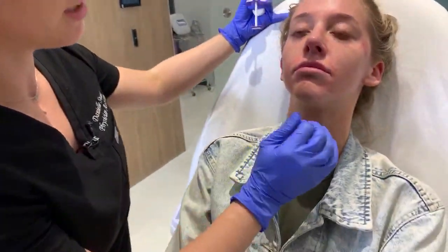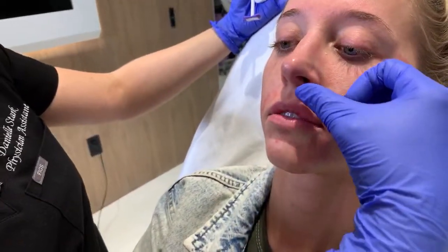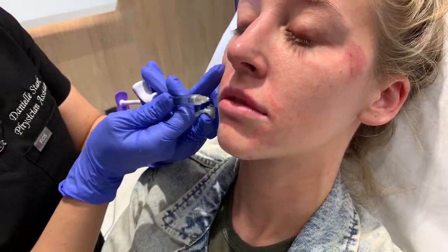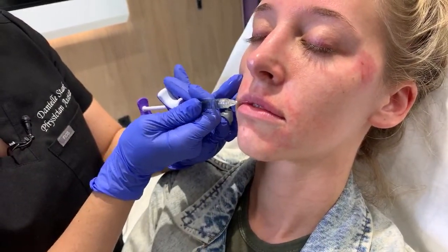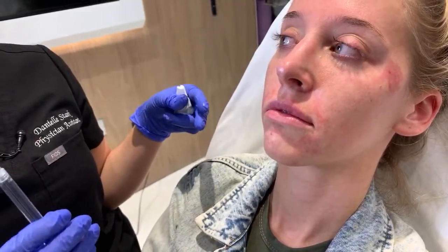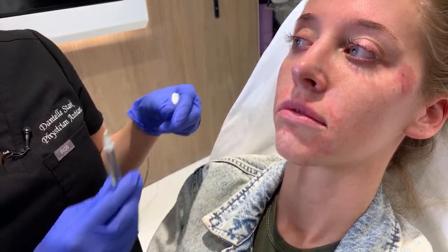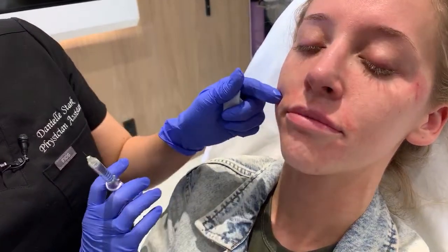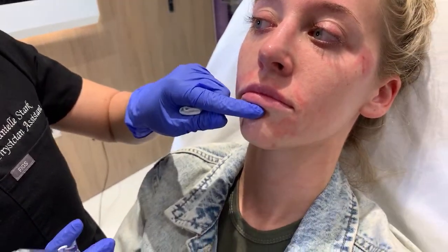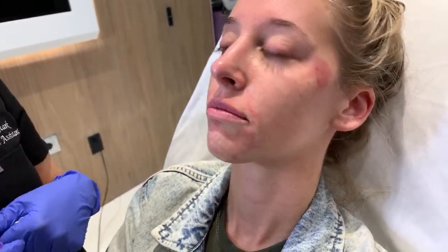Put your head back for me. So far I've injected just a touch up here. I'm going to point with my needle so don't move around, but she's got these little gaps kind of right in the middle and off to the sides of her upper lip. I just want to soften those so there's not much deviation through her shape, and then a little bit of enlargement. Not a ton of size on top, and then we're just going to go for a little bit of pouty volume on the bottom, and that's it.